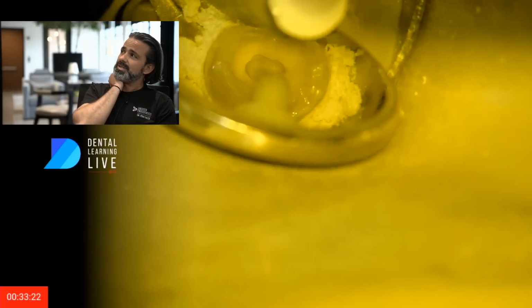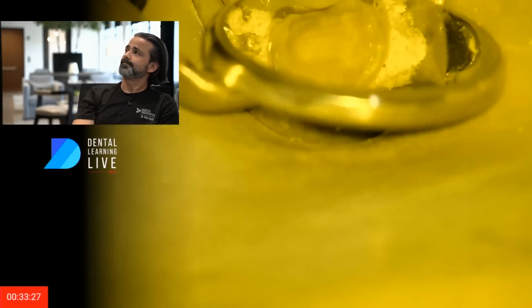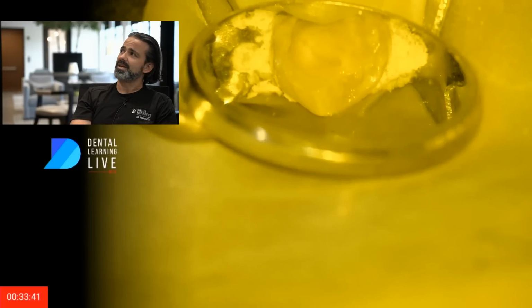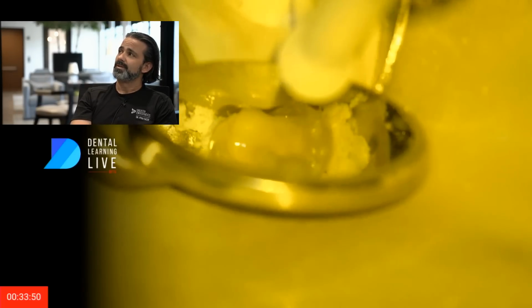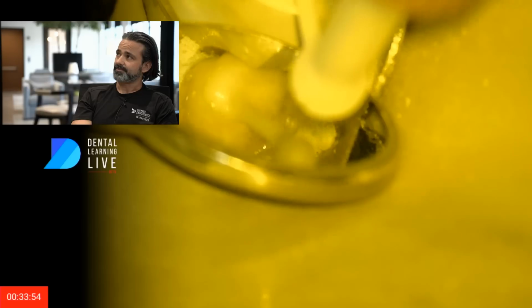And then I am using a buildup cement, comprimer, and just kind of doing some layers. I'll cure up to the chamber, if you will. So that first step was just a little bit countersunk inside the root, and then did a quick cure. This is a dual cure cement comprimer, and now I'm going to fill up the cavity.